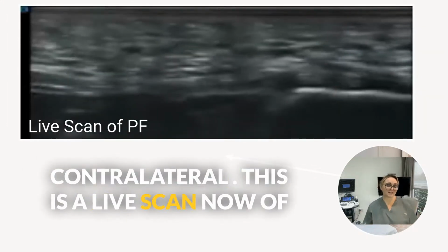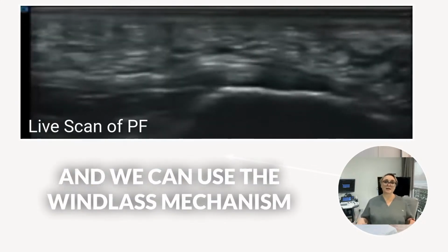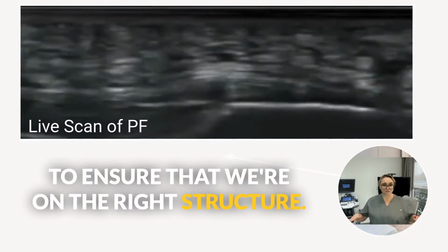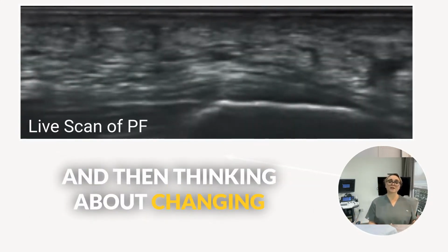This is a live scan now of the plantar fascia. We can see the calcaneus nicely, and we can use the windlass mechanism to ensure that we're on the right structure, optimizing our depth to see this image clearly, and then thinking about changing our frequency.